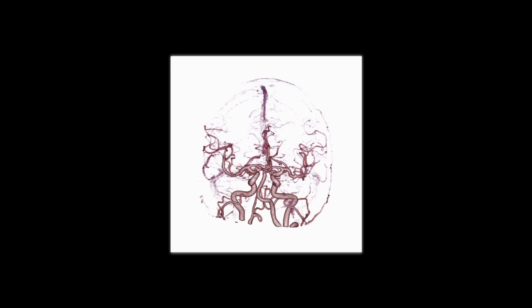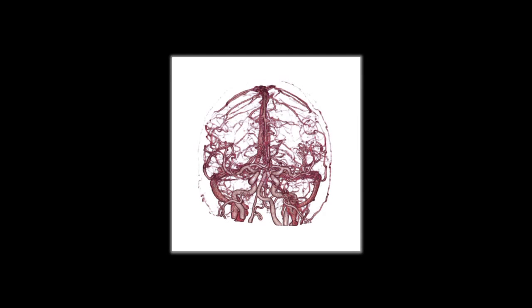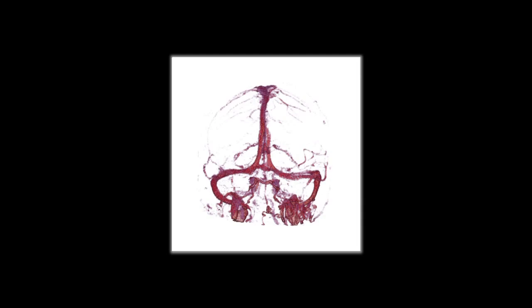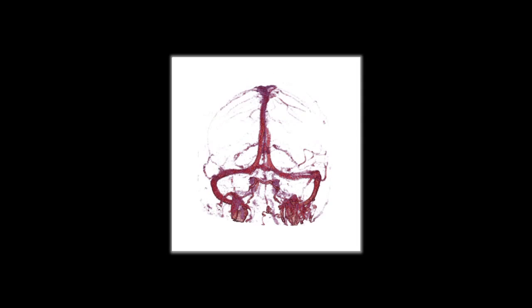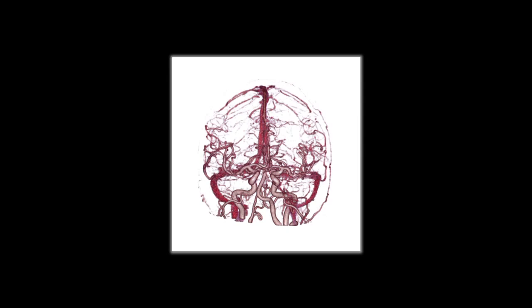As you know, routine Hounsfield-based bone removal can be a tedious and sometimes inaccurate process. Aquilion 1 does this work for you automatically. We also have volumes acquired before and after this arterial phase. By selecting the play icon, we are able to view these volumes in a temporal manner. And as you can see for the first time on CT, flow of contrast through the brain.